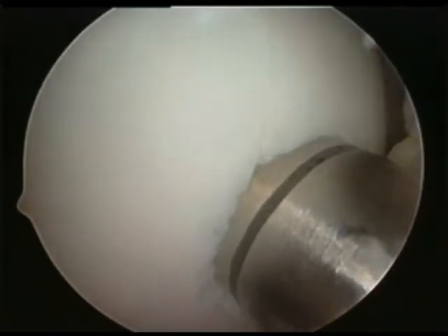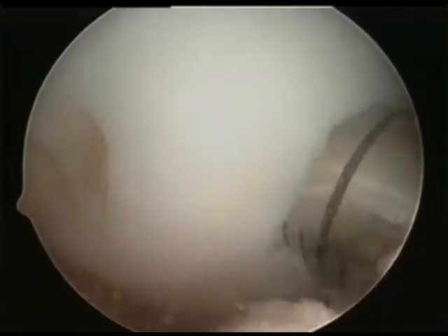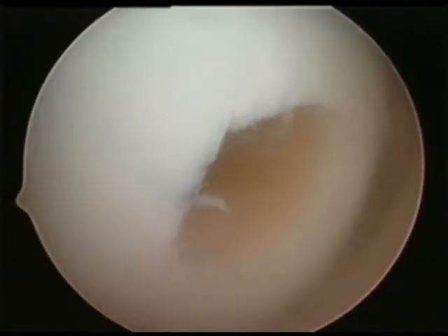Harvesting of the donor plug through an arthroscopic approach is quite difficult. Therefore, a small arthrotomy is used. The plug is typically obtained just proximal to the sulcus terminalis. This procedure is not demonstrated here.